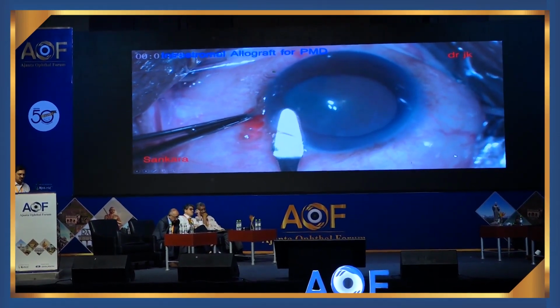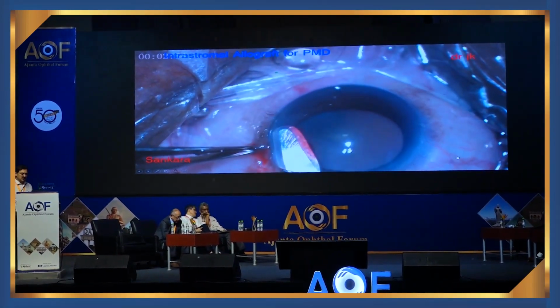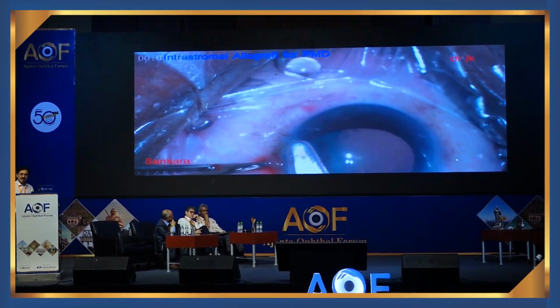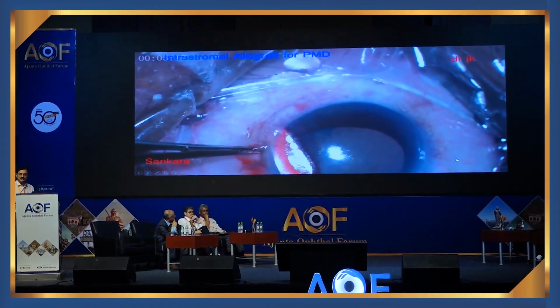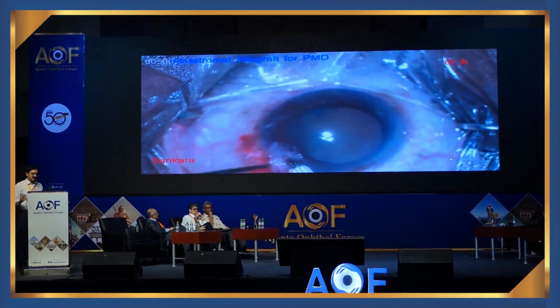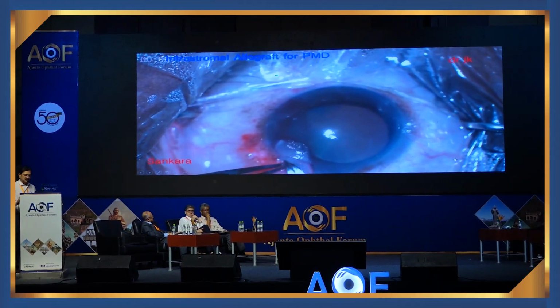It may take 1 to 2 minutes. Slowly you advance. You can go up to the opposite side and make a nice tunnel, and you are not touching the visual axis, unlike in keratoconus, where we are opening and putting a graft in the visual axis. And make a hand-fashioned graft, 300 to 350 microns, trim it and insert into this. That's so simple, and no sutures, nothing.